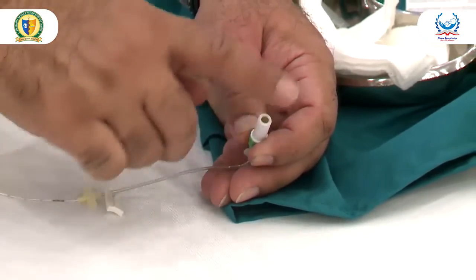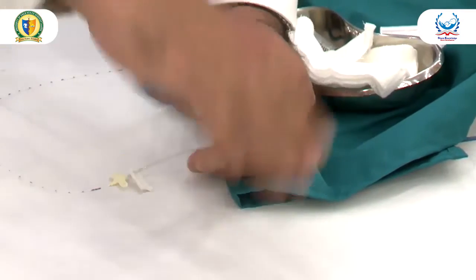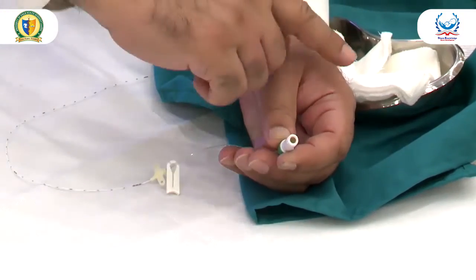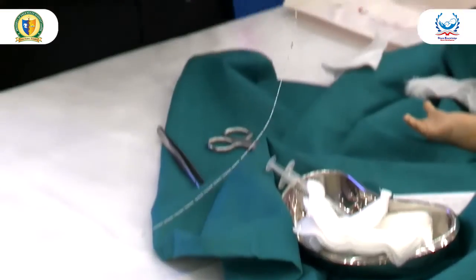You just clean it, and this is a luer lock. You can attach a syringe straight away, and if you remove it just like this, it's not going to bleed blood. So this is an advantage of this needle-less connector.